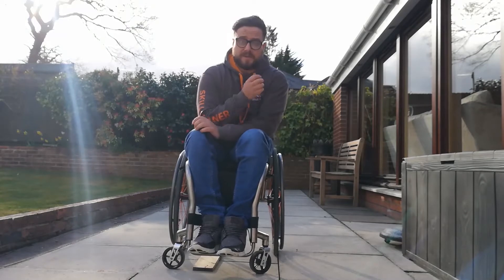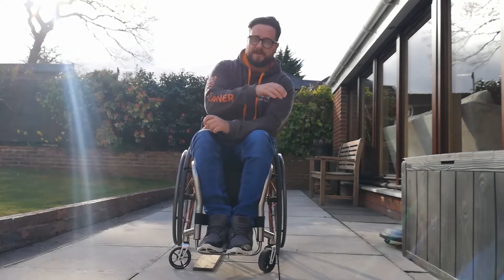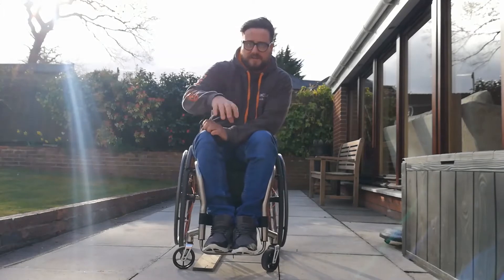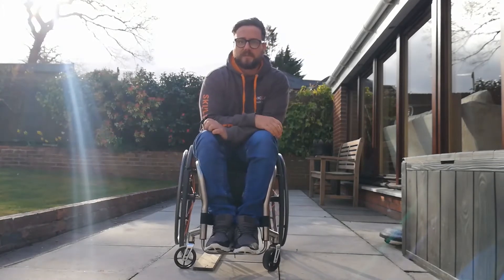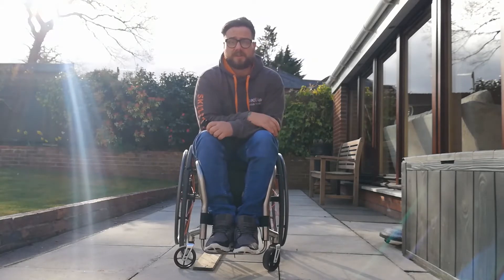A main one is getting into the big French bifold doors. Often they've got PVC runners along the bottom, so that's quite a big threshold to get up and over. So it's quite a useful skill for that.